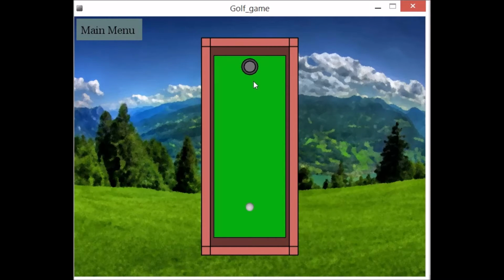So when I flex my arm, this is hooked up to my forearm right now, the ball will travel, and you can see it didn't go very far that time. Now when I flex my arm again, it'll keep traveling. Again, not very far. Now if I try really hard, it goes further. So this is how someone could train themselves to use their muscle better and be able to contract for longer.